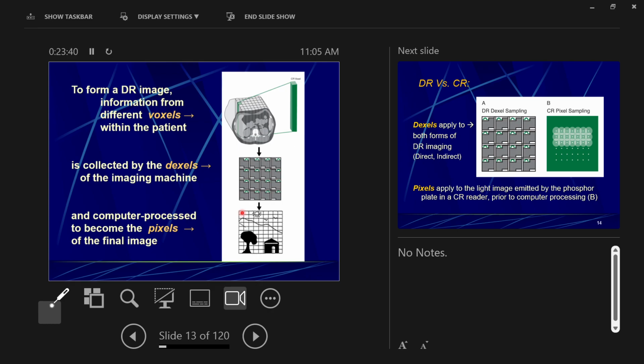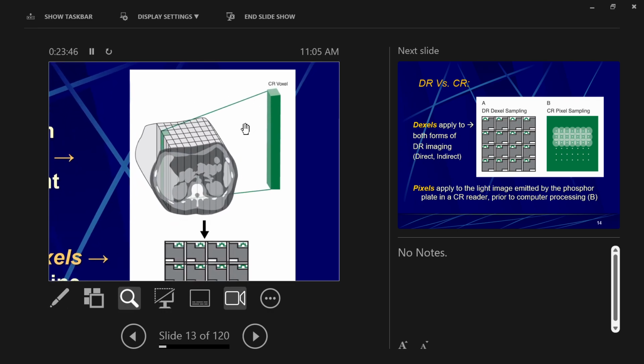Can you kind of describe voxels? Yeah, just so I get a better understanding. Yeah. So you can imagine, right, this square there being what you see on the TV screen, right? So I show you, sure.